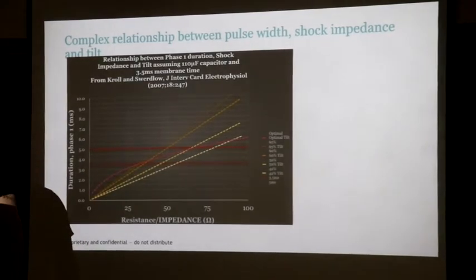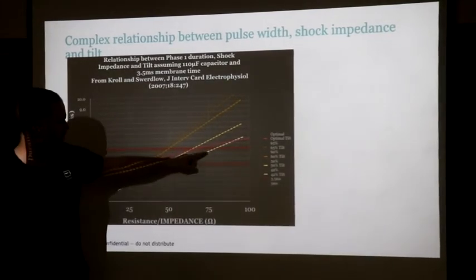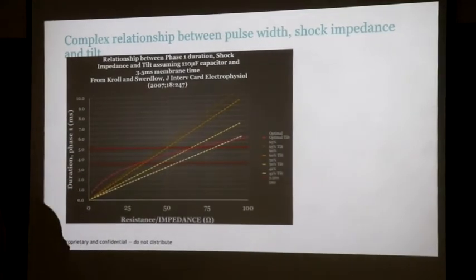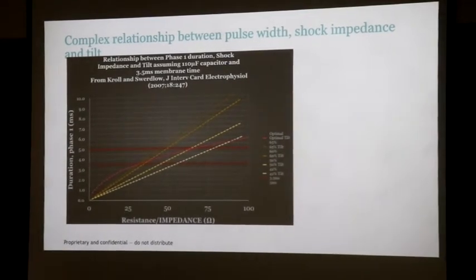Because that 75 ohms, it's in the band that we want to be in. The shock duration is going to go shorter. Does that change the DFT number? Yes. So we will reduce his DFT by doing that.